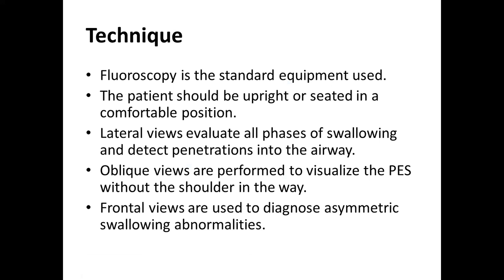So the technique for us to do this study, we usually use fluoroscopy, which is standard equipment for contrast studies. The patient should be in an upright position or seated, depending on the patient's condition, because some patients do not have the energy to stand upright. Most patients who have problems with the esophagus also have problems with eating, which leads to weight loss and loss of energy.